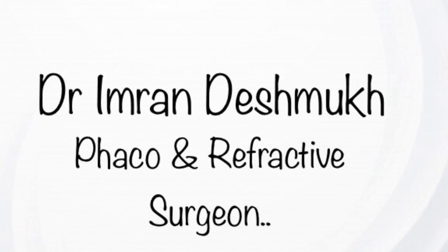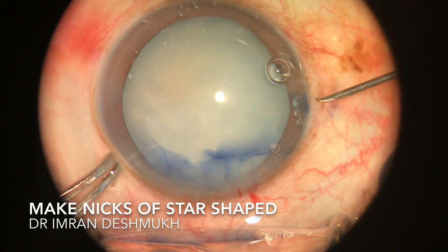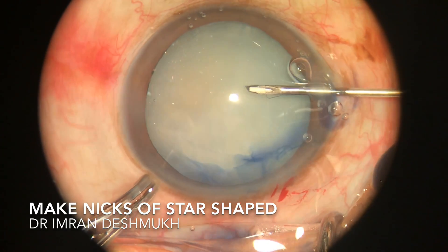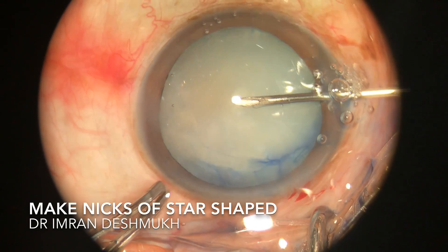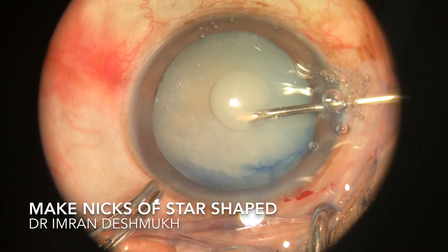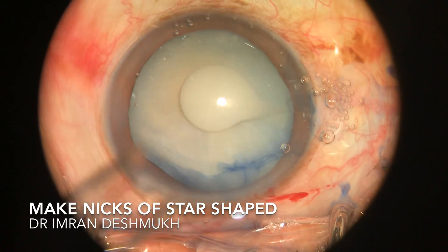Hello everyone. Today we'll be discussing how to make capsulorhexis in a case of intumescent cataract. This is the most important step and the most difficult part of intumescent cataract surgery. I usually enter through the sideport and make a star-shaped nick and incision on the anterior capsule so that the rhexis does not extend off.